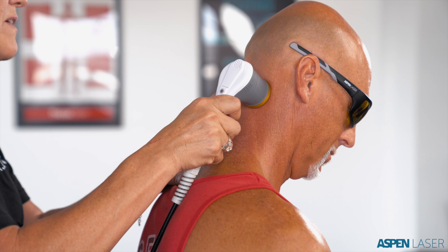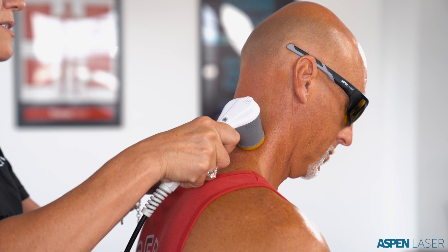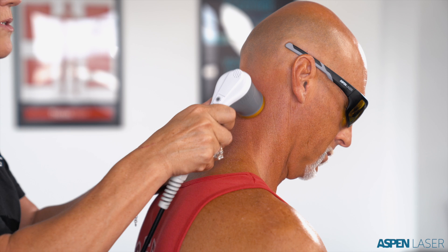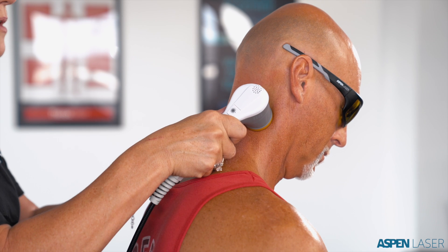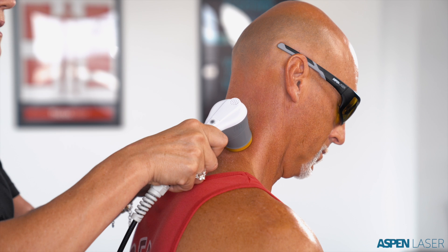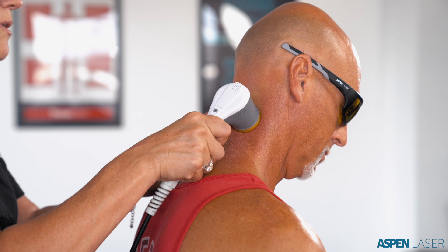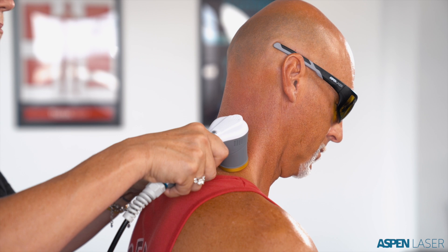I'll ask the client if they've ever used laser therapy before. If this is their first session, most of the time they say no. I explain that light is very much like photosynthesis — our cells absorb the light and use that energy to increase circulation, decrease inflammation, and accelerate the rate and quality of tissue repair. It's extremely important that the handpiece is moved as slowly as possible. The slower the handpiece is moved, the more depth of penetration we achieve and the more photons we deliver to deeper targets. I also use firm pressure because it blanches blood and lymphatic fluid from the tissue, allowing light to penetrate more deeply — and as a manual therapy, it feels good and accelerates pain management outcomes.